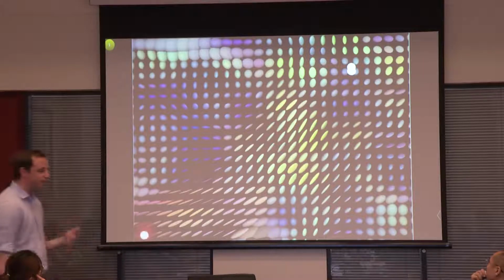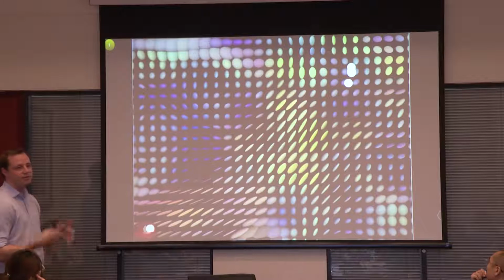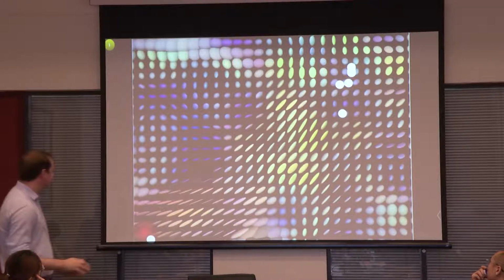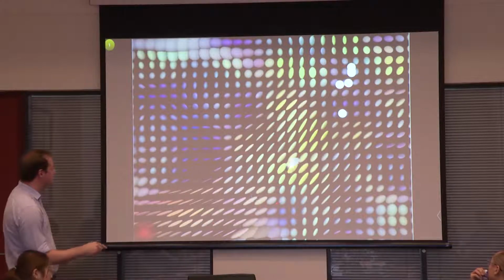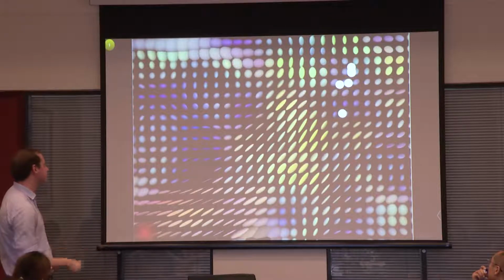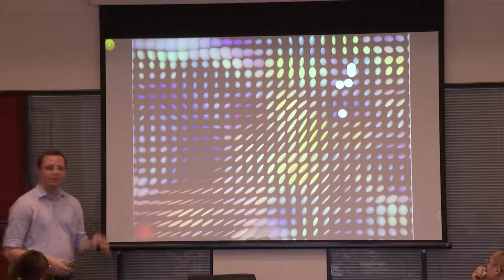We could do this a lot of times and maybe add some probability function, and then it's called probabilistic tractography. Then maybe sometimes, because of probability, we end up in some very different place, right? Because sometimes we take a different route. And then we could draw a heat map of what is connected or not.